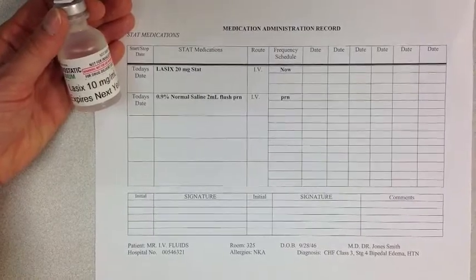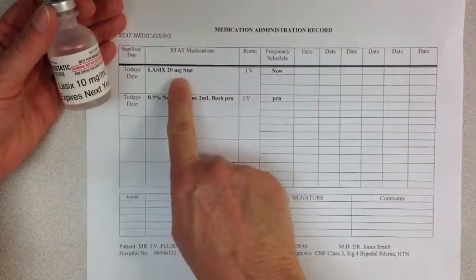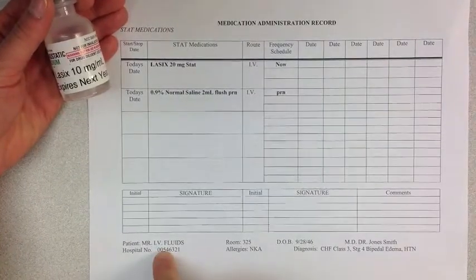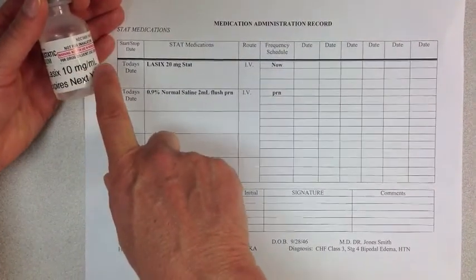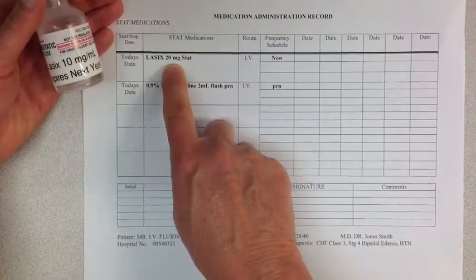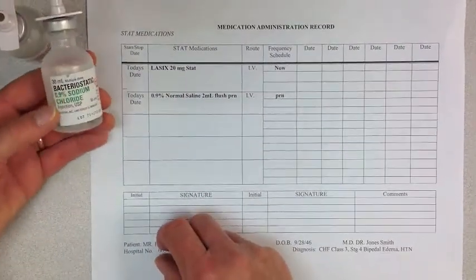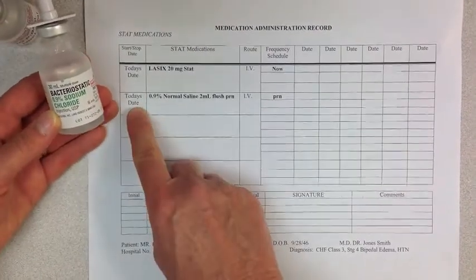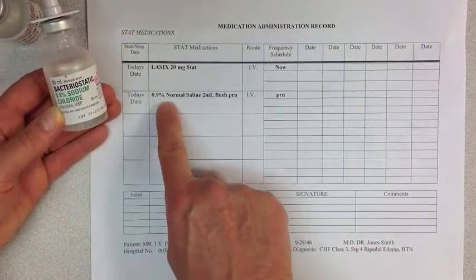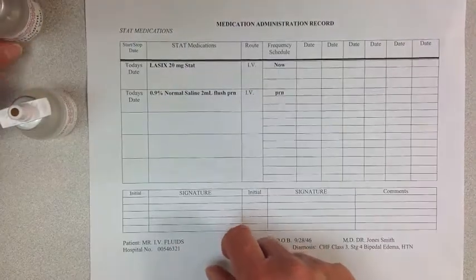Now I'm going to do the 3 checks of the 5 rights. My first check, today's date, Lasix 20 milligrams stat IV now. In my hand I have for Mr. IV Fluids, Lasix 10 milligrams per ml. It expires next year. Because I have an order for 20 milligrams, I'll need to draw up 2 mLs. First check on the Lasix is done. My first check on the sodium chloride is today's date for Mr. IV Fluids, 0.9% normal saline, 2 ml flush, PRN, IV. So my first check is done.